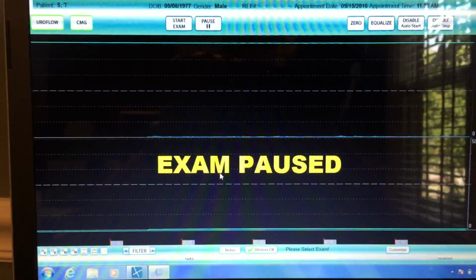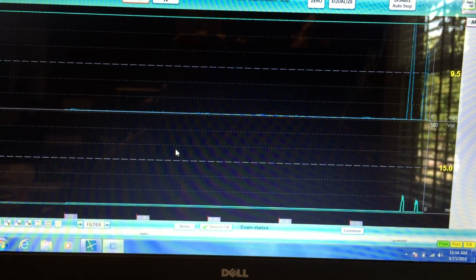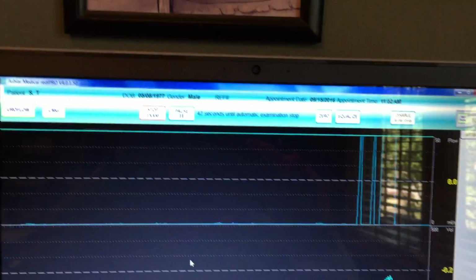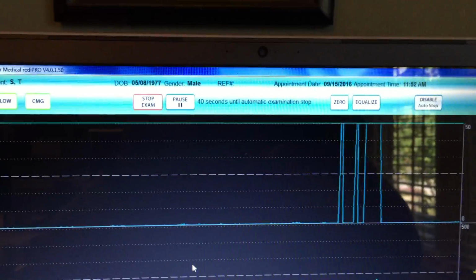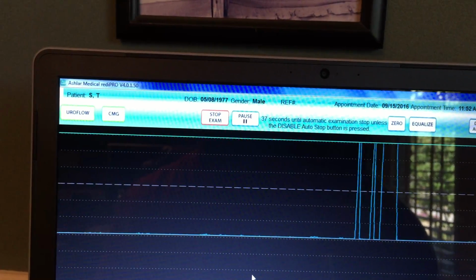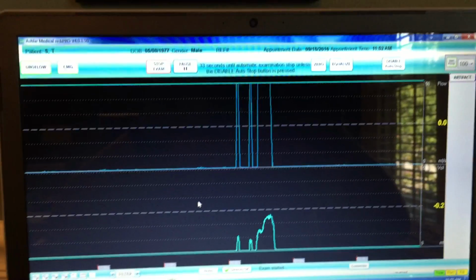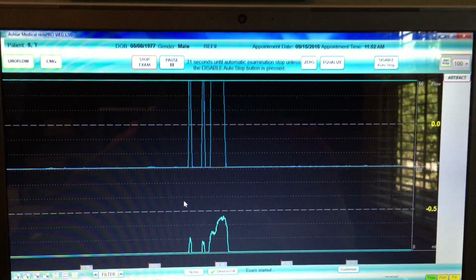So as I put a little bit of pressure on the Uroflow scale, so the patient walks in and starts to void, the software will automatically pick it up and start recording the study. The default on this one, which I haven't changed, is at 45 seconds. So this is really good for male patients who come in, are voiding, and think they're done, then all of a sudden they have to void a little bit more. So we're going to continue to record for another 45 seconds after the equipment picks up the void.